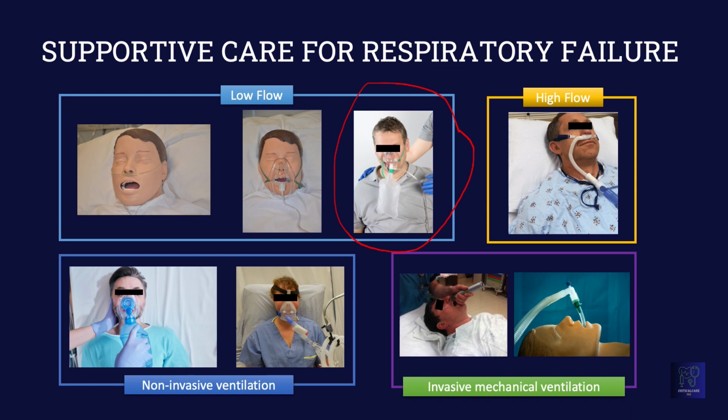It is also a very simple and easily available device, compared to, let's say, a high flow or non-invasive ventilation. If you pick high flow, you have to decide what FiO2 and what flow you are going to be using. If you pick non-invasive ventilation, you have to decide FiO2, the CPAP or EPAP and IPAP, and you usually need a respiratory therapist to help set up the equipment. Versus a non-rebreather mask, where all you have to say is put on a non-rebreather mask. You don't even have to think about any settings. The flow is fixed at 15 liters per minute. The FiO2 is fixed at 100%.